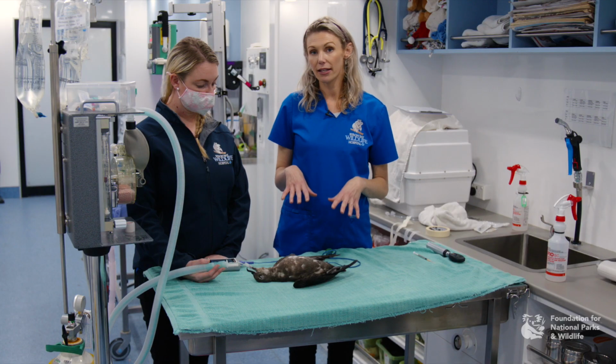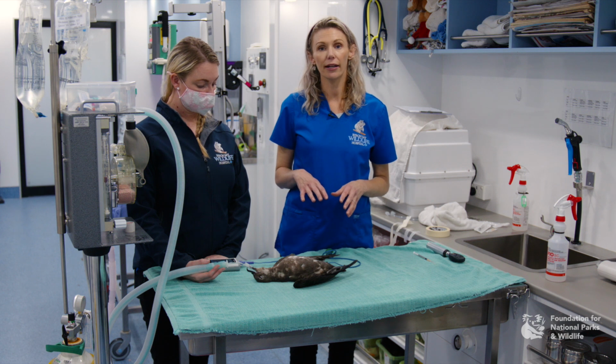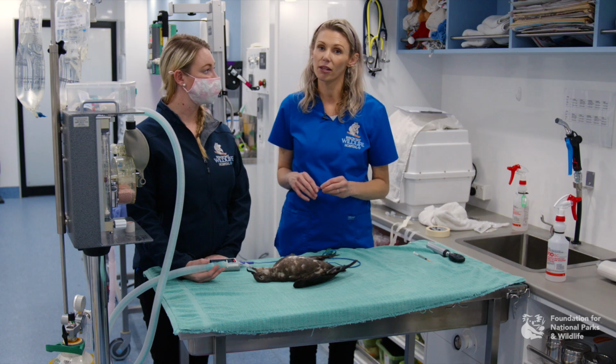If your IV access points are not available to you, you can go into cardiac, but please only do this under anaesthetic and only do this if you don't have any other places to go.